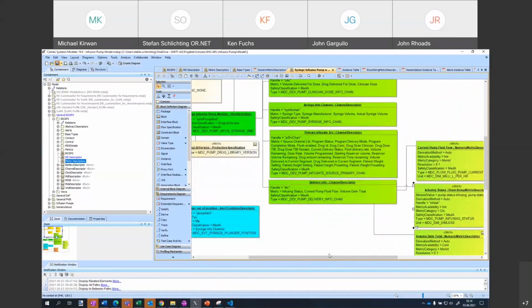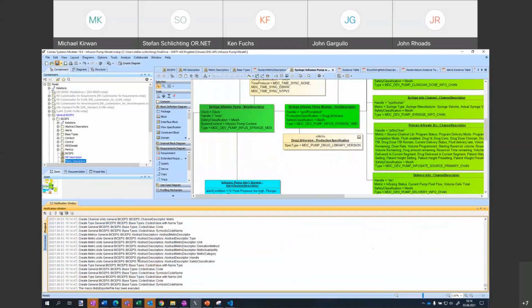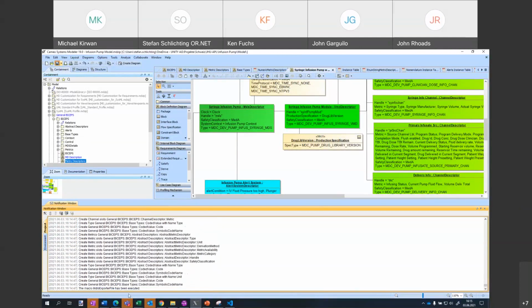Yeah, so this is what we did so far, and what you can do now from within Cameo is you can actually generate an MDIB XML representation out of it, which you could use and load into your preferred Python simulator or use as a starting point for your product. So I just kicked it off, did some debug work in the background.